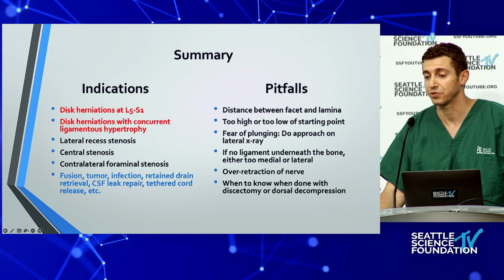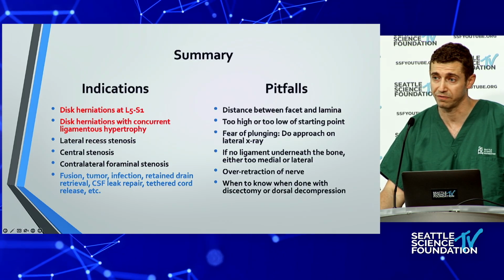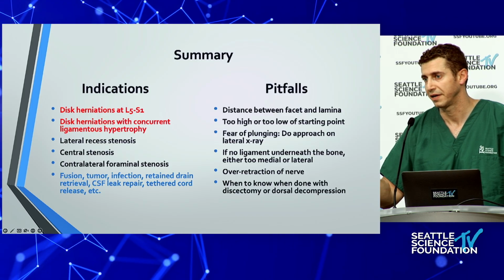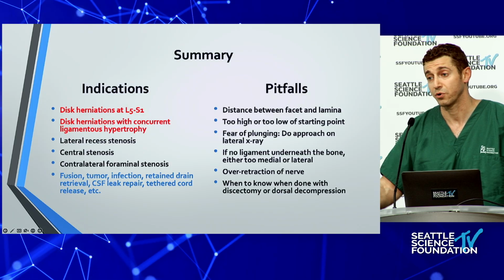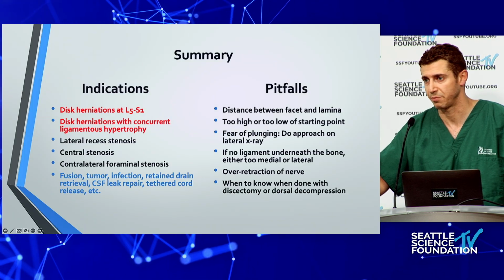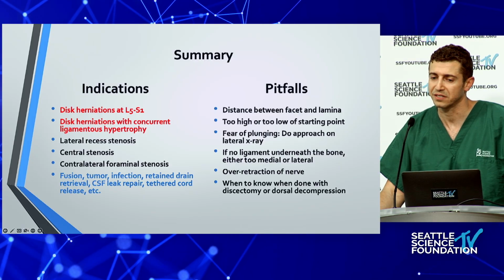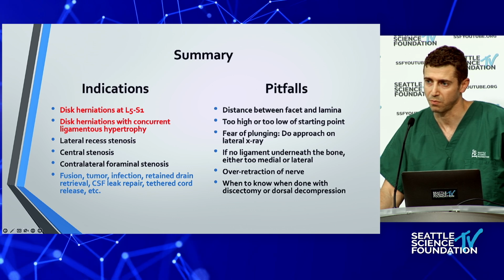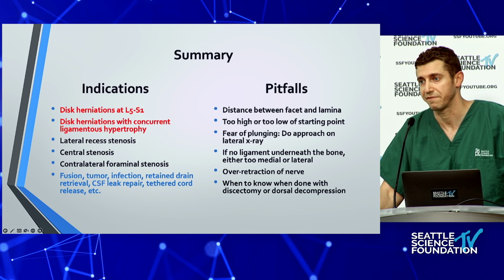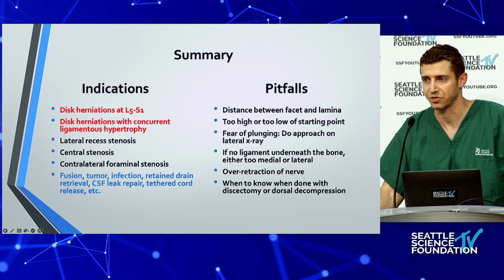And in terms of treating it, actually it's much easier than anything else, because as long as there are no nerve roots that are injured, you're able to put some type of onlay and then glue, and it's good enough. If there are rootlets popping out, then you do want to put in an inlay. So get a Duragen or whatever you use and push it in there, to at least get things out of your way. But the nice thing is because the dead space is so small, it usually doesn't cause any problems. I've had a lot of durotomies, especially when I first started, and none required me to come back and put in a lumbar drain or anything like that.